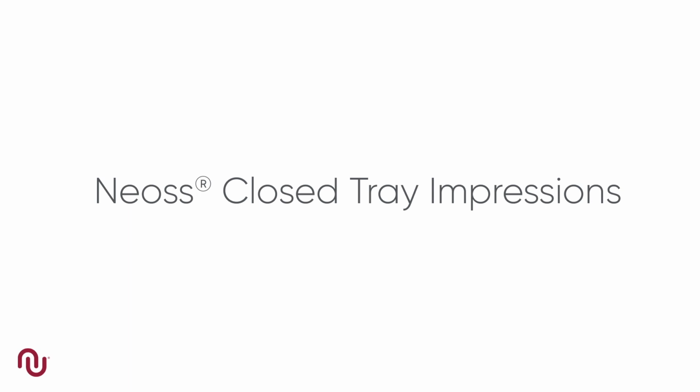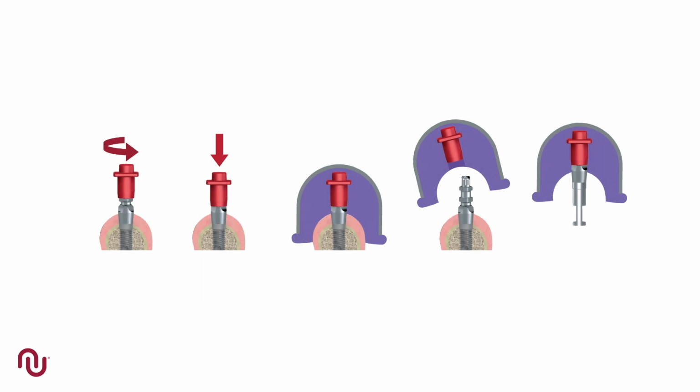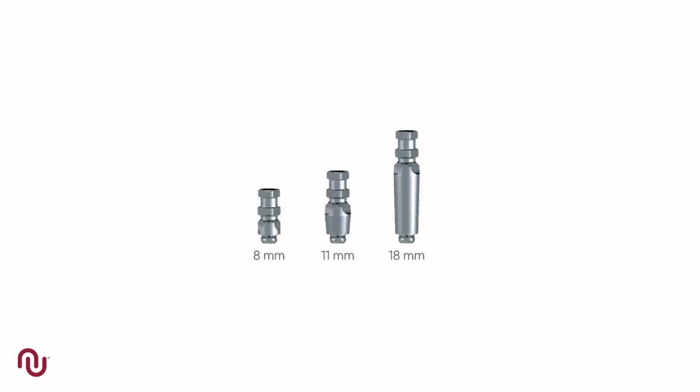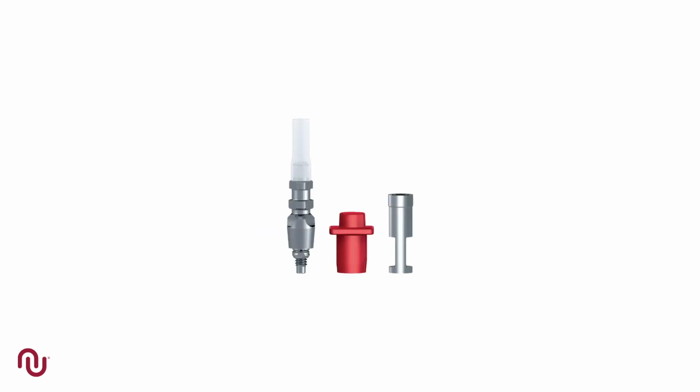In this video, we will demonstrate the use of the Neoss closed tray impression technique. In the closed tray technique, the impression coping remains in the patient's mouth when the impression is removed. The Neoss closed tray impression coping is available in 3 different lengths and is packaged in a kit consisting of the coping, screw, a plastic extension sleeve, a red cap and replica.